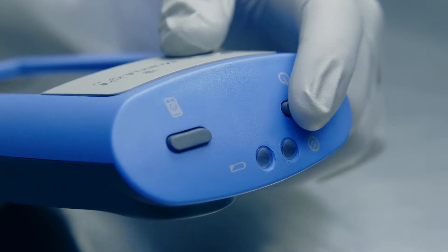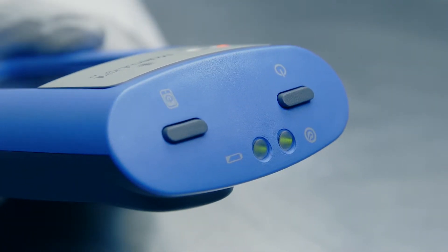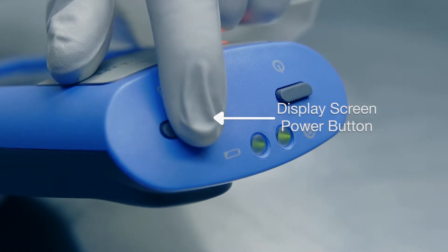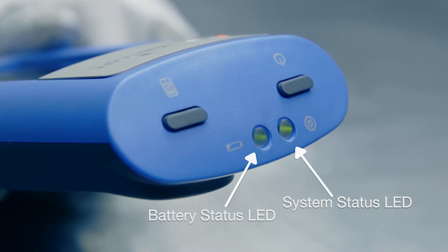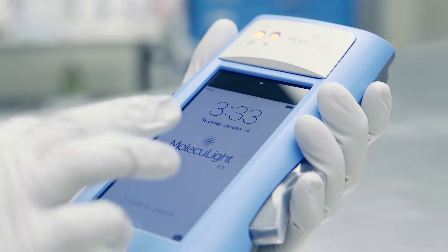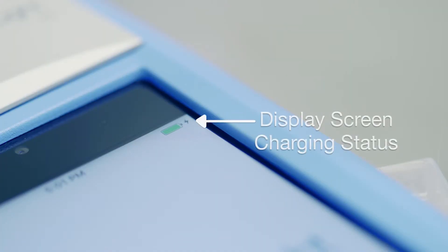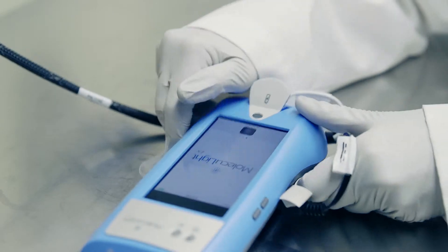To turn on the iX, simply hold down the device power button for three seconds until the LEDs flash and come on. Then hold down the display screen power button for three seconds as well. You'll see that the system status LED and the battery status LED are both green and you can see the display screen powering up. Just like when the iX display screen was charging, you can monitor the battery status on the top right corner of the display screen. And now the device is ready to take those important images.